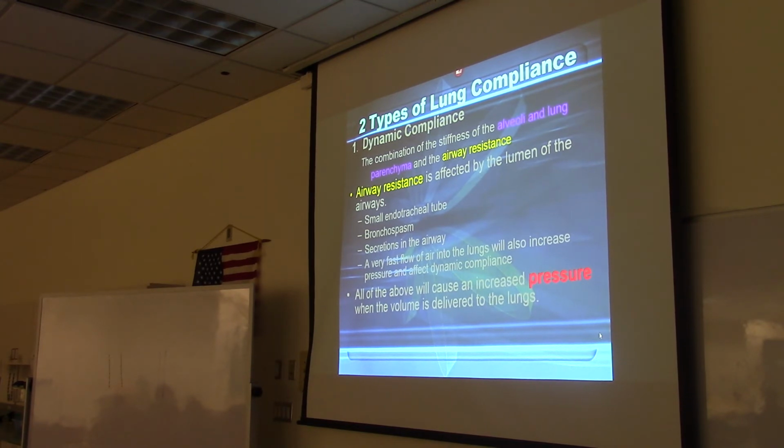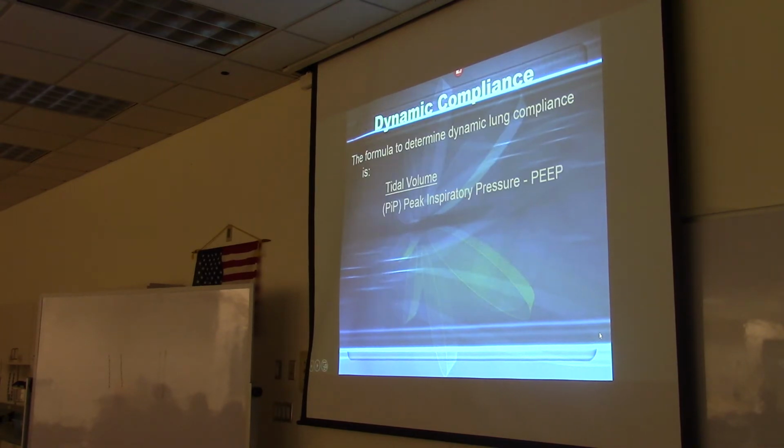All of the above will cause an increased pressure when the volume is delivered to the lungs. Good so far? Okay, so the formula we talked about already. We put the tidal volume on top and the change in pressure on the bottom.